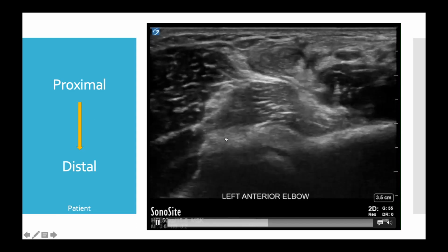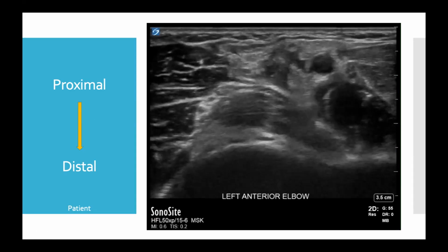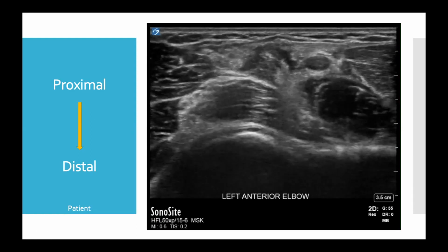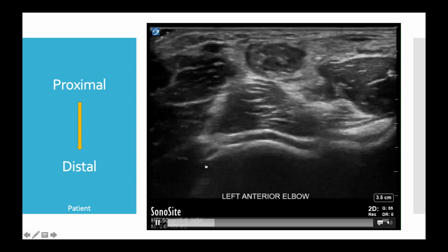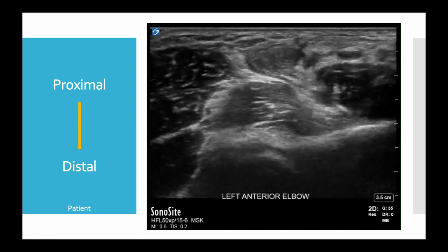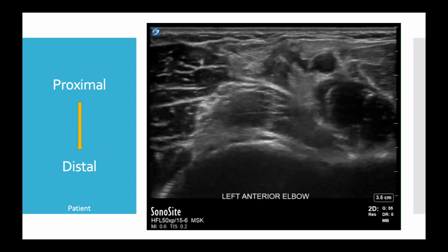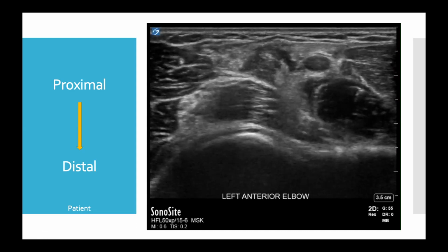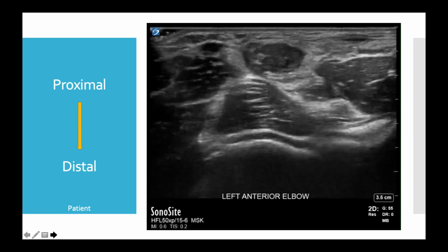As you can see, it remains quite edematous, and it looks like there's fluid interspersed within it. It's hypoechoic as we get closer to that home base. And we're seeing that hypoechoic signal a lot sooner than we would anticipate if the tendon were intact, when we would think we were going to see anisotropy. That hypoechoic signal is a lot more proximal than what we would anticipate.